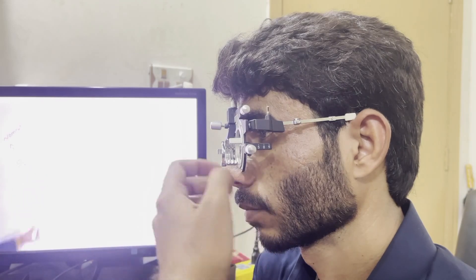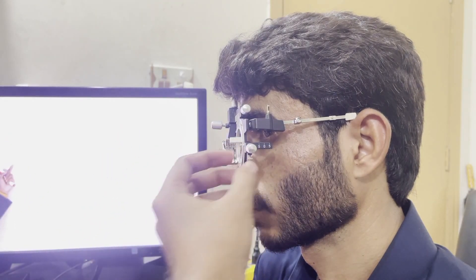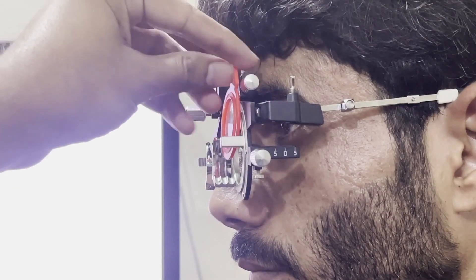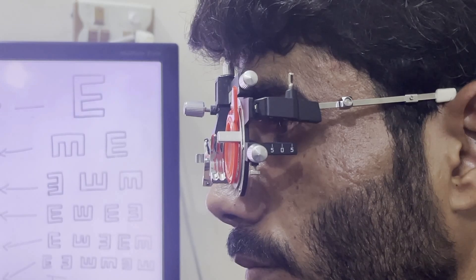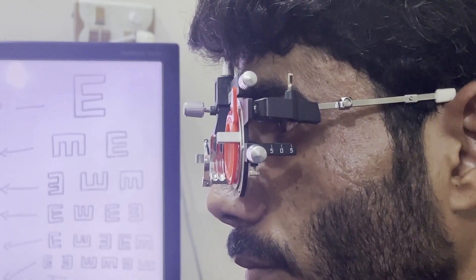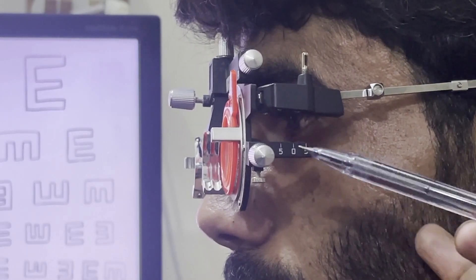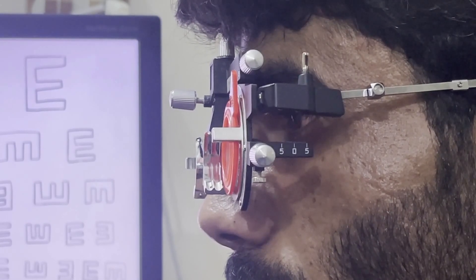We can measure the back vertex distance with the help of these values. We adjust the spherical lens before the patient's eye, and we can find the distance between the back of that lens and the cornea of the patient. These values are for the measurement of the back vertex distance.